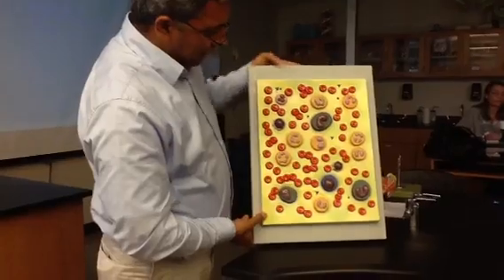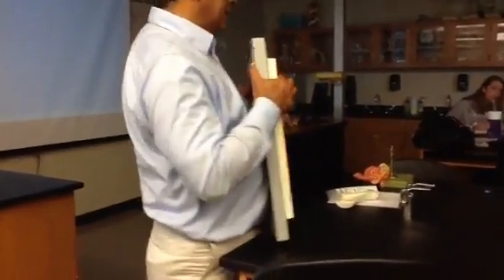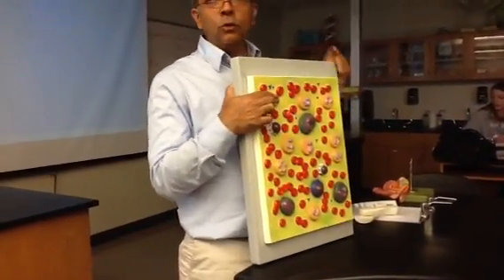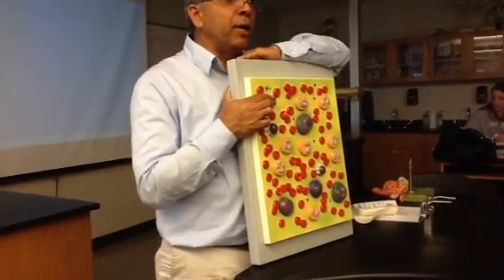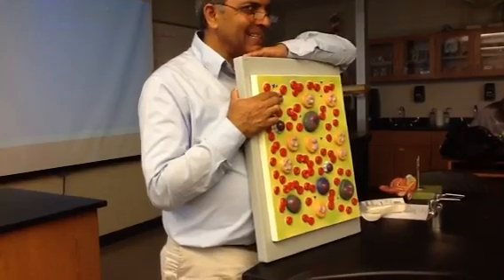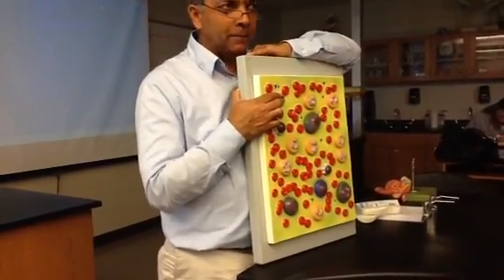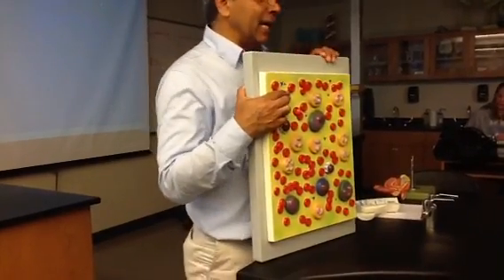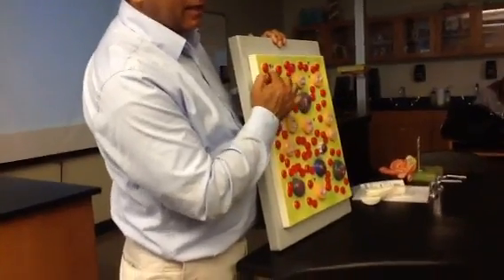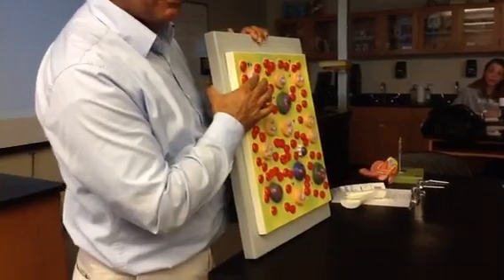Okay? Now, in addition to this, you have a cell that's almost 0.5% of the white blood cell population. And this cell has granules that are dark blue or dark violet in color. So there are dark blue, very basophilic, a violet color, deep, then this is a basophil. 0.5% of the white blood cells are basophils.